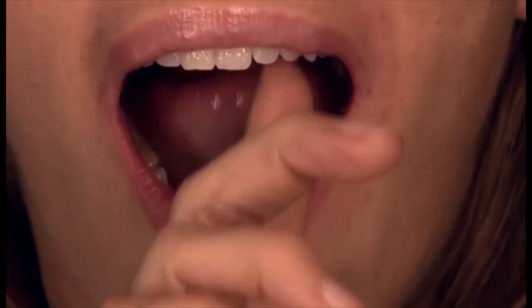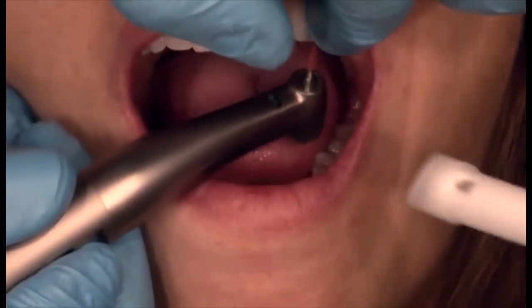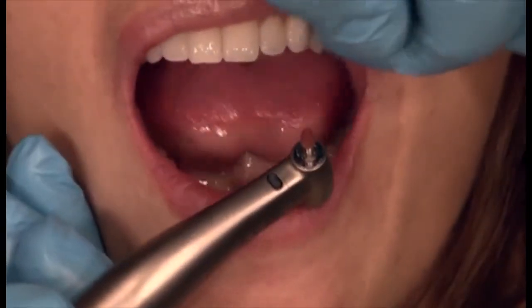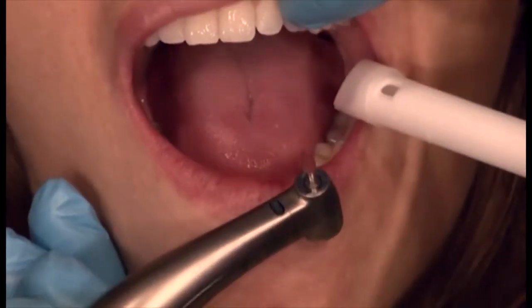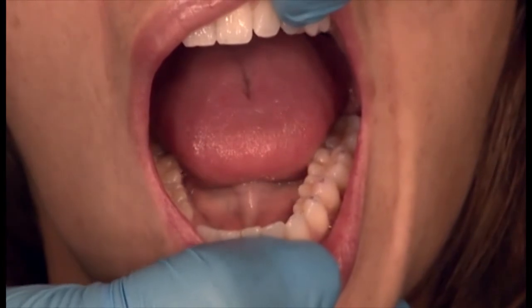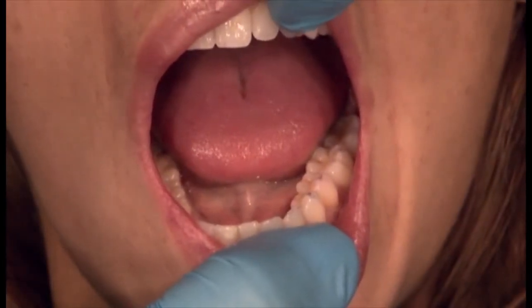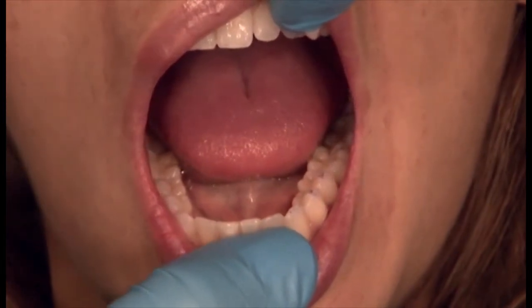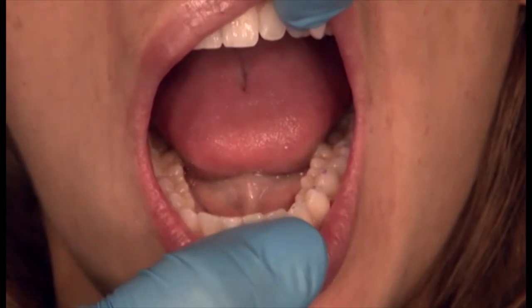No. Just tiny bit. Tiny bit up here. Yes. All right, let's try that. Which tooth? This one or this one? That one. Okay, and right now I'm starting to get a contact on this cuspid. If you can see the little spot on the cuspid, they're just starting to couple now. So we should be pretty close to the very end of this equilibration.